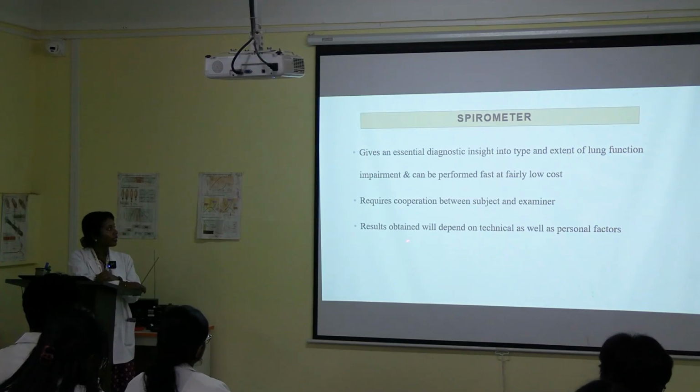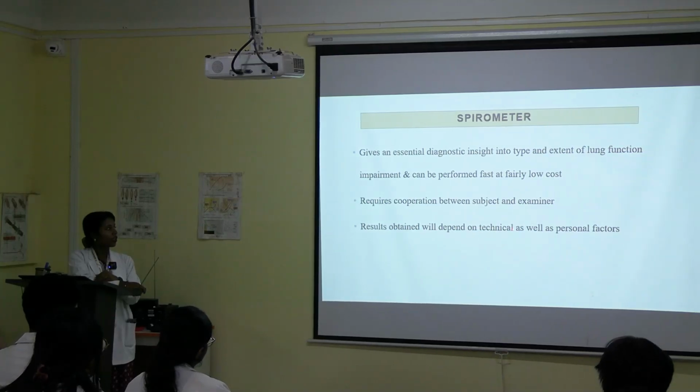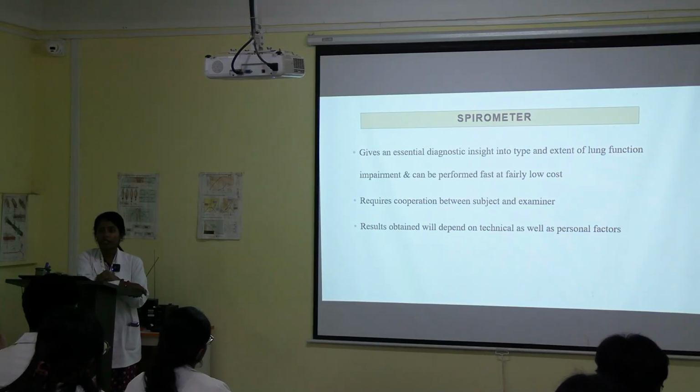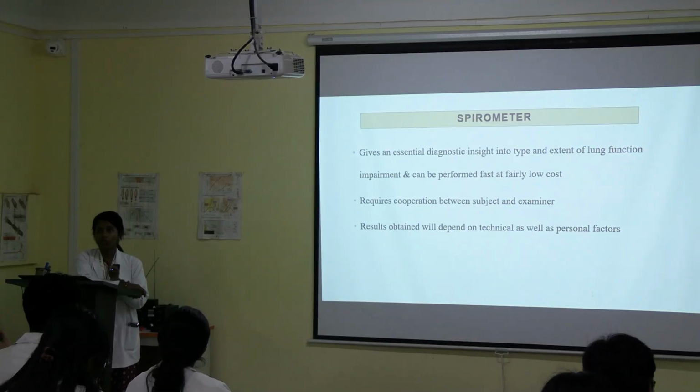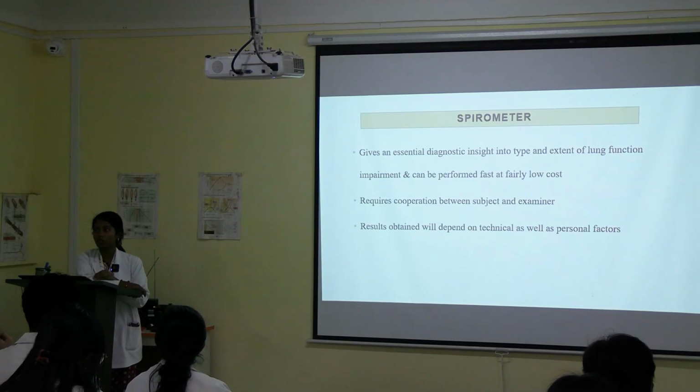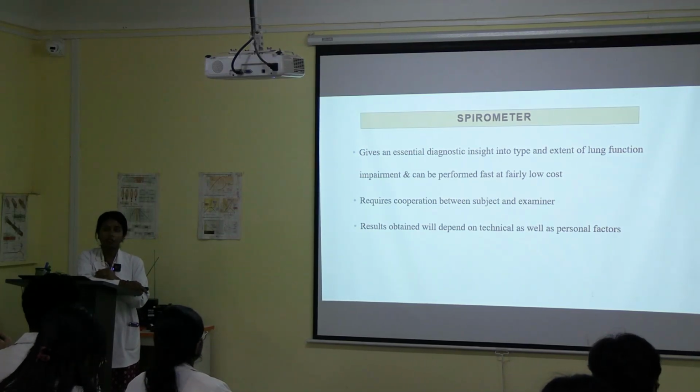The results obtained will depend on technical as well as personal factors. Personal factors will be like your age, gender, fitness of the individual. Then posture: is he performing in standing posture, sitting posture, or lying? In those conditions also the values will be different.